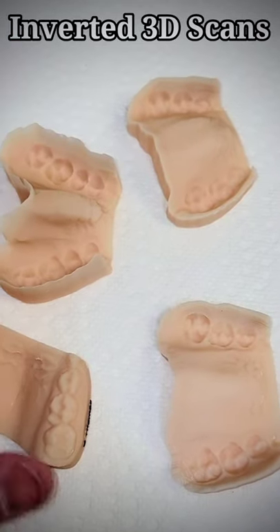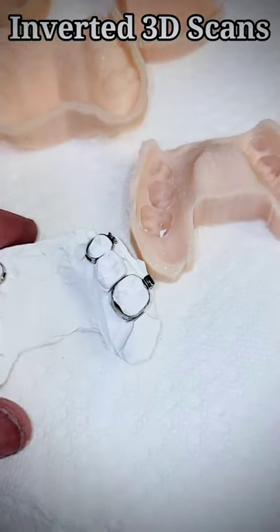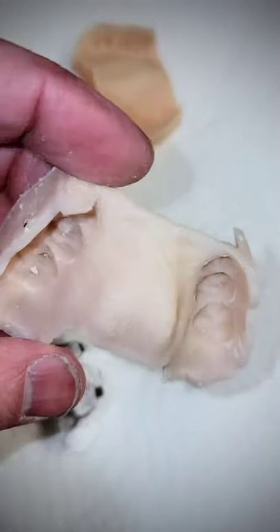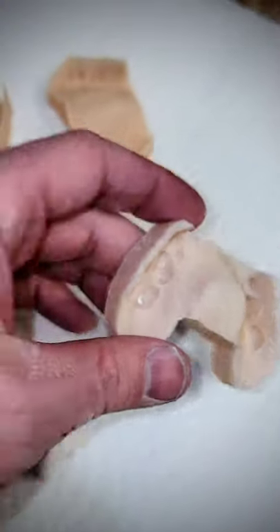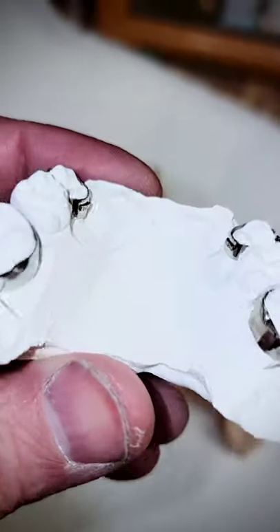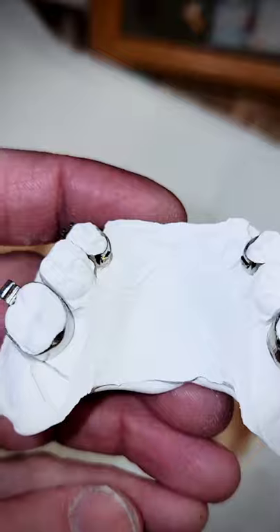I've been reversing images to make it easier to fit band. So why would you want to bother doing a reverse image and pouring it up? So we can get back to doing what we used to do: making perfect expanders.